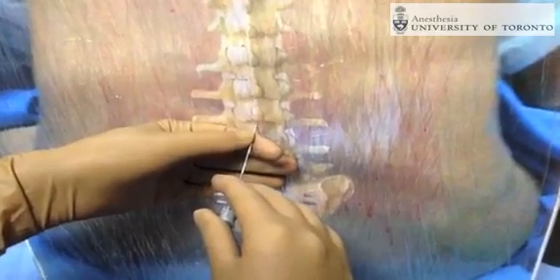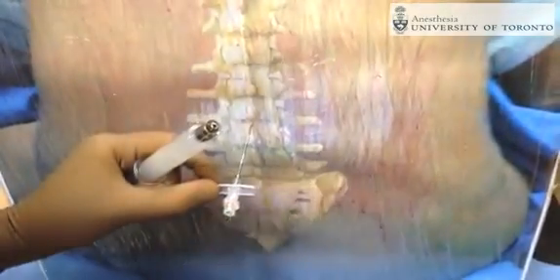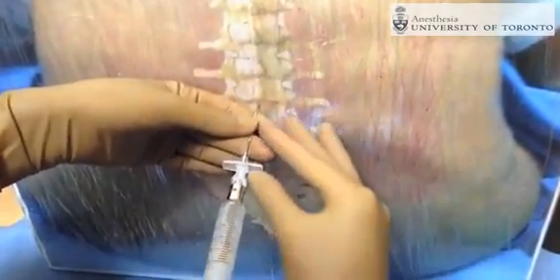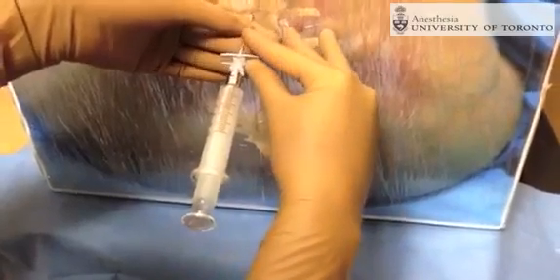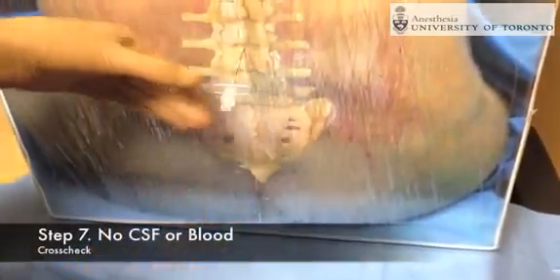The epidural needle is then advanced until the classic feel of the ligaments is obtained. Once this is obtained, the stylet of the epidural needle is removed, a syringe is then placed on the end of the epidural needle, and a classic loss of resistance technique is initiated. Once loss of resistance is obtained, the epidural space has been found.